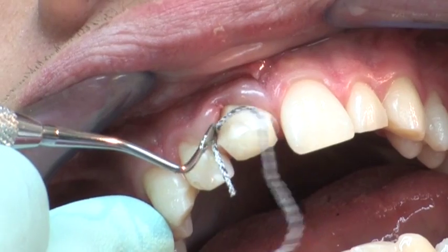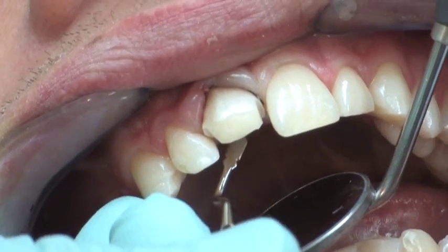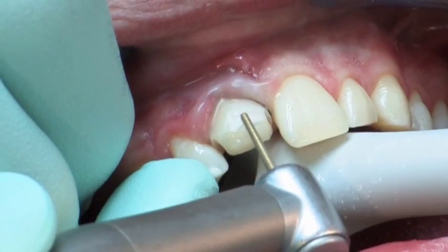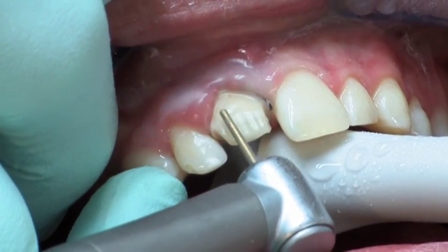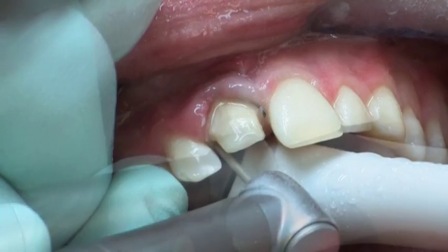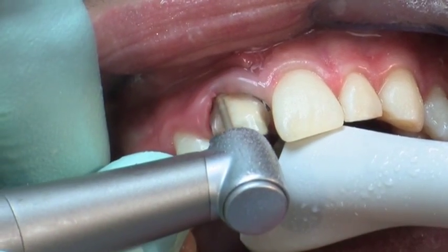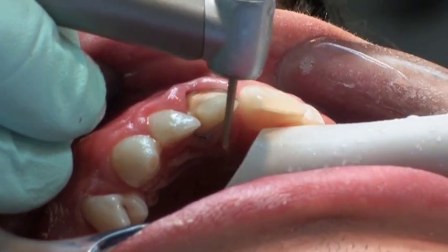In order to protect the gingival tissue during the crown preparation, a thin retraction cord is placed into the sulcus. The preparation can now be performed effortlessly using a 40 micrometer diamond instrument. Due to the dentin-like hardness of ParaCore, the transition between natural dentin and the core buildup is hardly noticeable during the preparation.